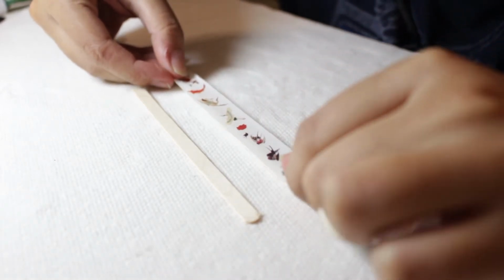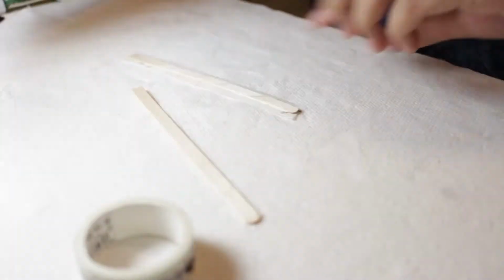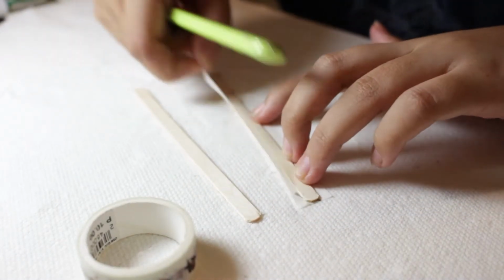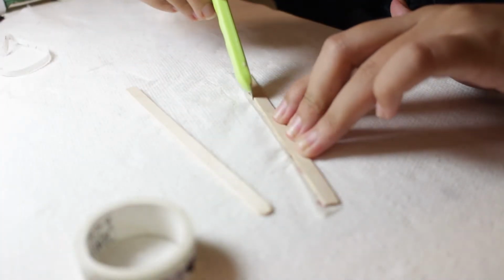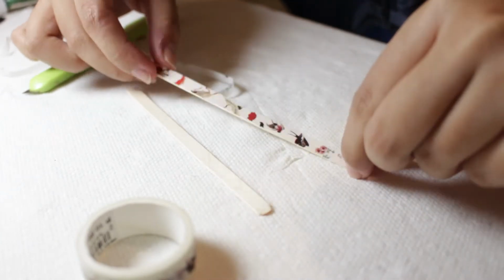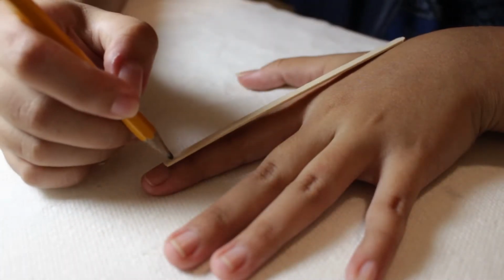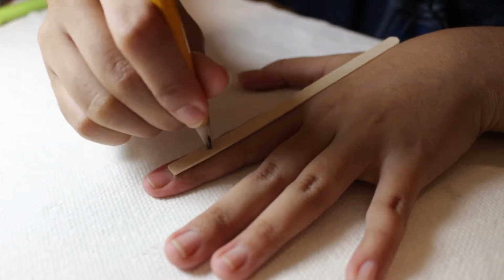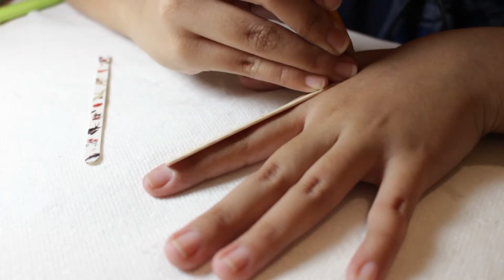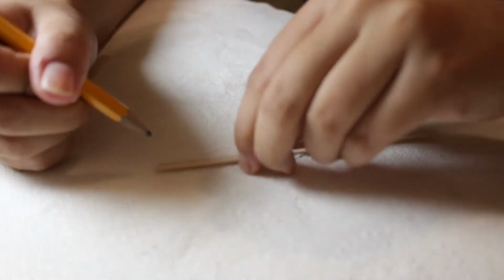Cover the other popsicle stick with decorative tape. This will be the top and exposed part of the splint. Cut off the excess tape to keep it clean. Next, with the plain popsicle stick, measure out or mark the middle of the bellies of the phalanges, and also the middle of the metacarpal. This will be where we will glue our Velcro.